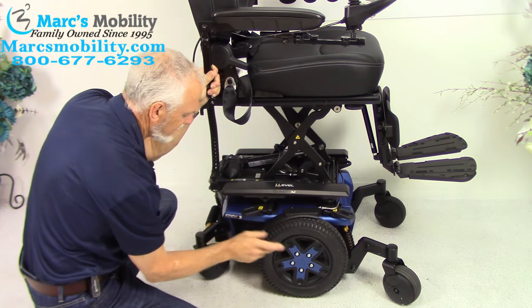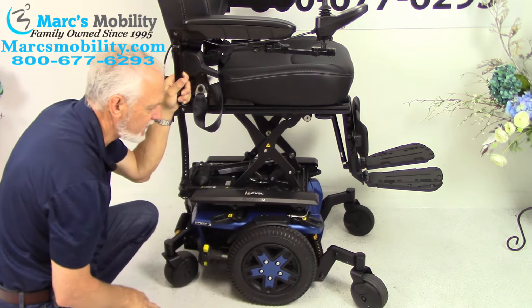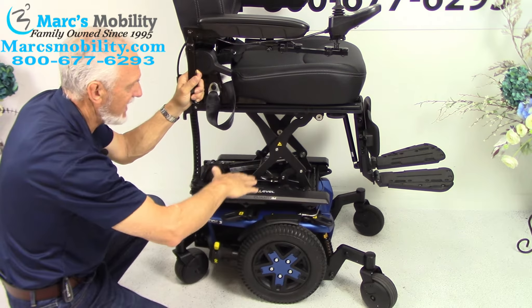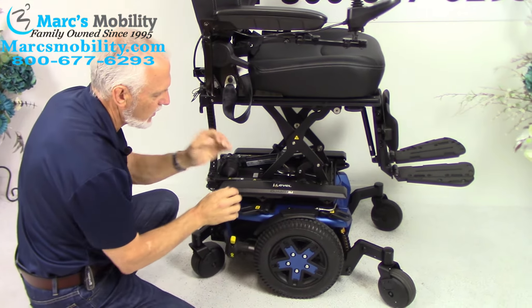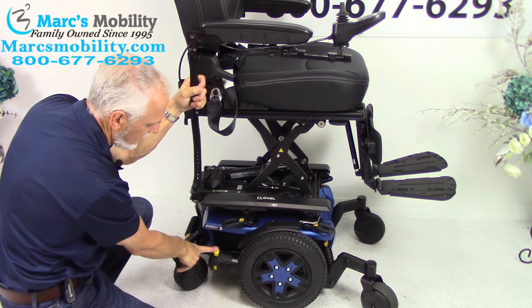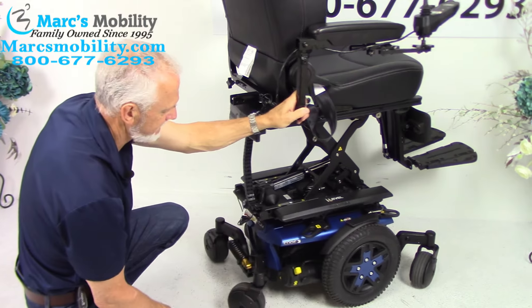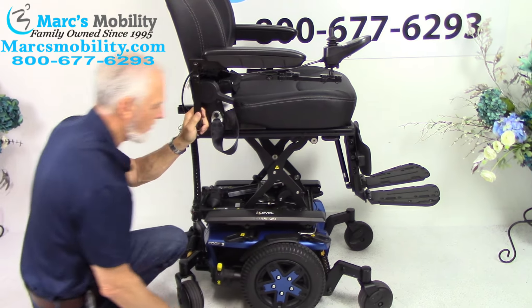There's a motor for each wheel — each wheel has an independent motor, which is what makes the chair turn in a complete circle. This chair probably weighs 300 to 350 pounds. If you need to push it manually, you want no resistance in the motor, so turn the power off and put it in neutral. There's a yellow handle here — push it down and the wheel rolls freely. You have to do both motors, then turn your power back on.